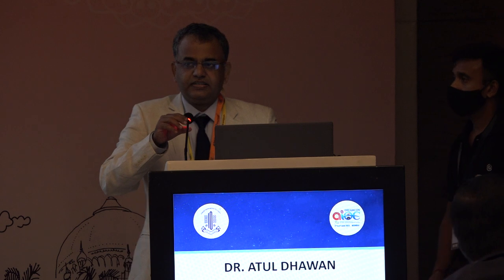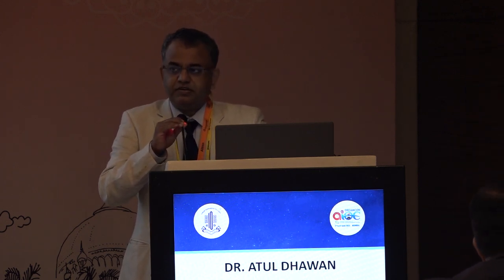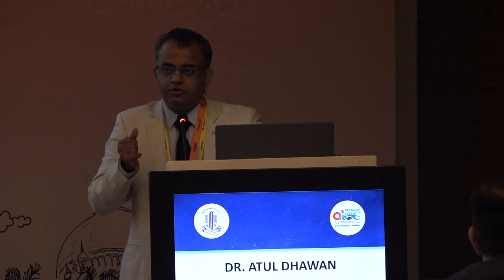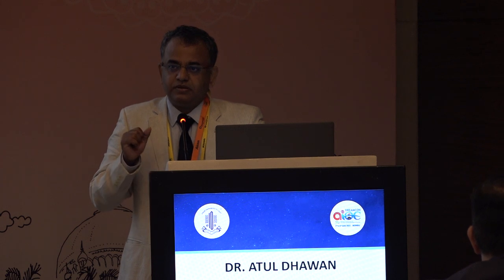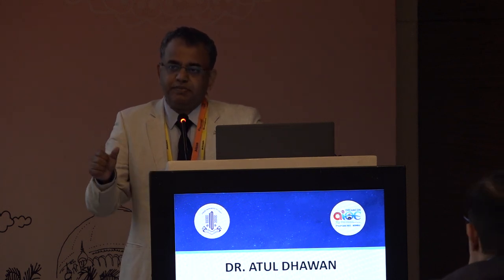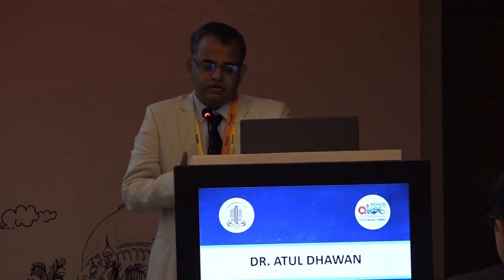The second problem is, in a case of PVR, if the oil has gone subretinal after the first surgery, how to remove the subretinal oil? In a normal case, the answer is you have to make a big retinotomy and retinectomy near the side of the oil, and then you have to take it out.